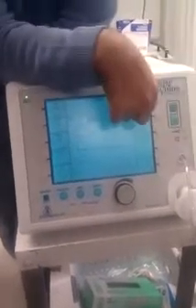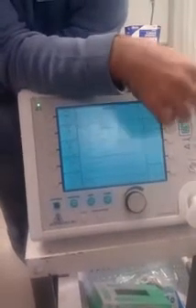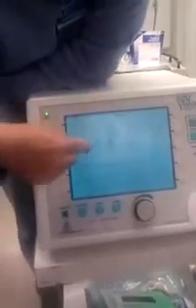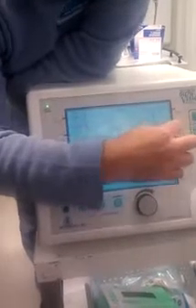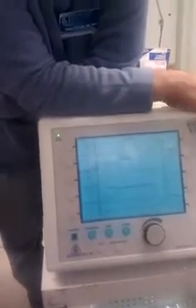I wouldn't really focus on this right now because you're going to learn more about it in detail, and the book probably has a better explanation than I do. Look over here, look at all your waveforms, and if you go shorter, you'll probably see it. This was one of the hardest checkoffs because it goes into more of the ventilator stuff. You'll probably know the ventilator's next one, the one after. And non-invasive ventilation is easy.